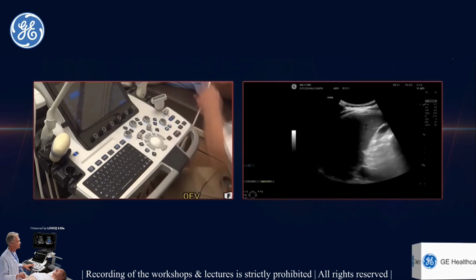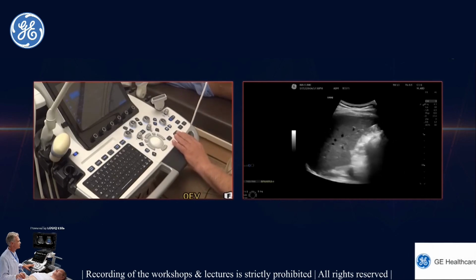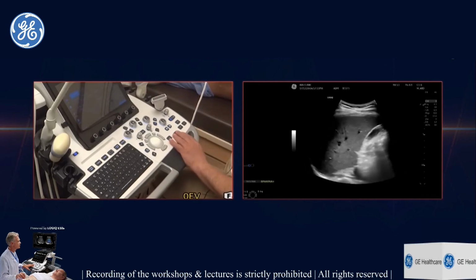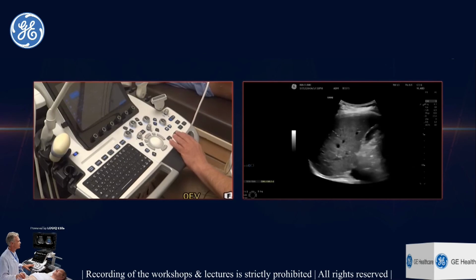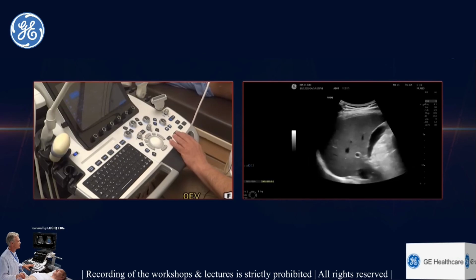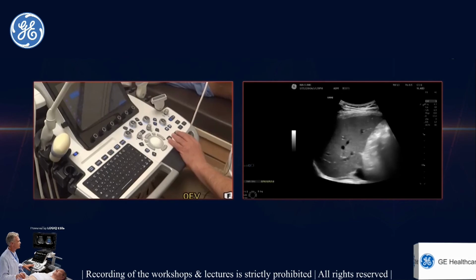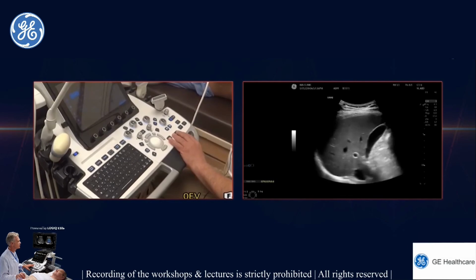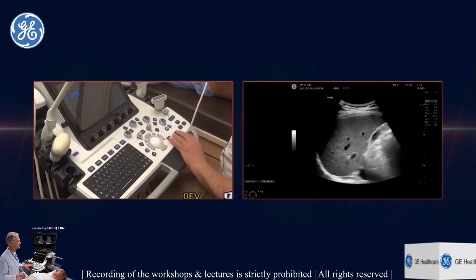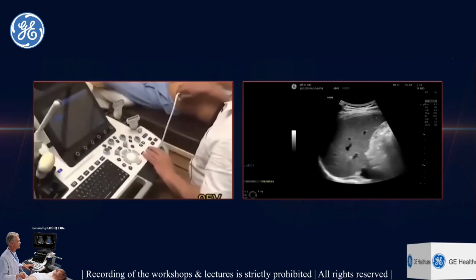My transducer is absolutely perpendicular to the patient. That's very, very important in the intercostal spaces. Segment 5, 6, 7, 8, wherever we get a segment of no hepatic vasculature and no interfering other lesion. We then keep the patient in supine or left lateral decubitus with the arms outstretched so that the intercostal spaces are wide, and we tell the patient to have 4 hours of fasting, and we will make him suspend respiration when we are actually doing the new techniques.